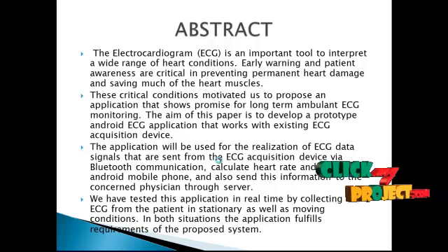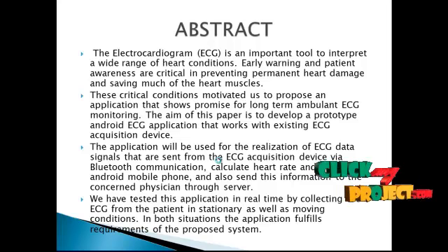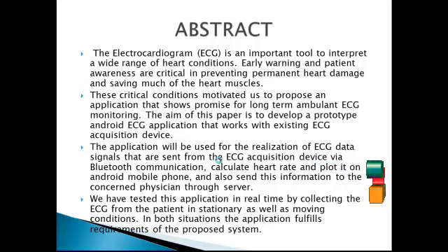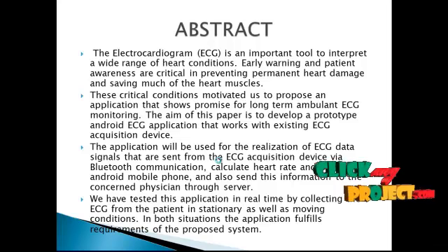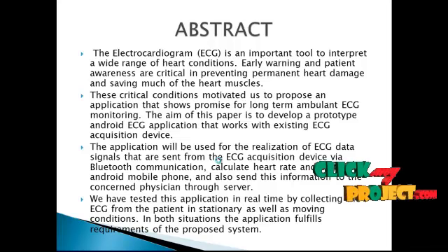We will be using 3 ECG sensor electrodes to measure the ECG signal. A biopotential electrode is a transducer that senses the ion distribution on the surface of the tissue and converts the ion current to electronic current. An electrolyte solution is placed on the side of the electrodes.